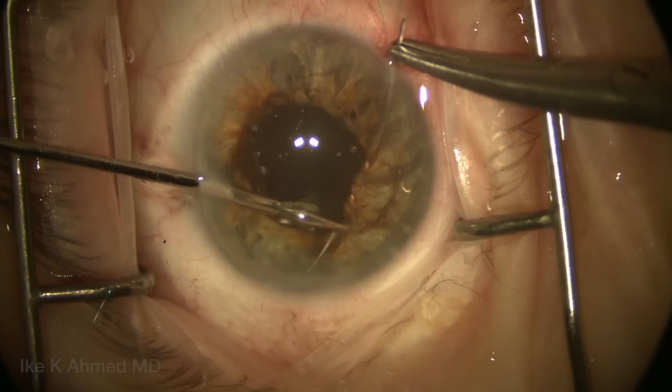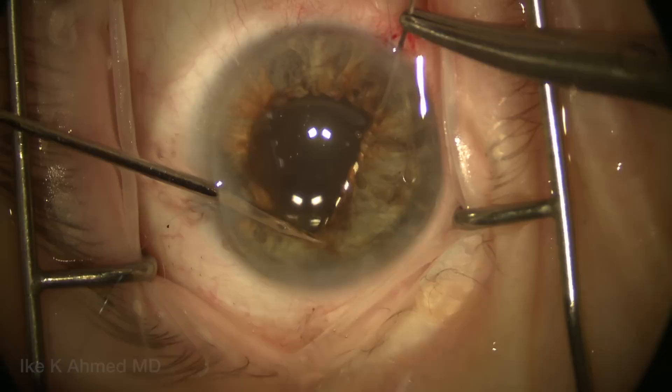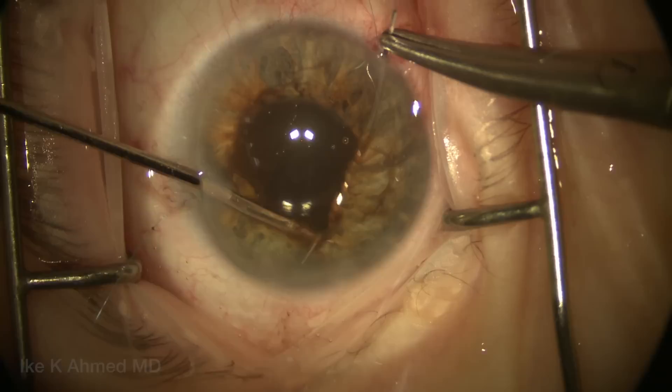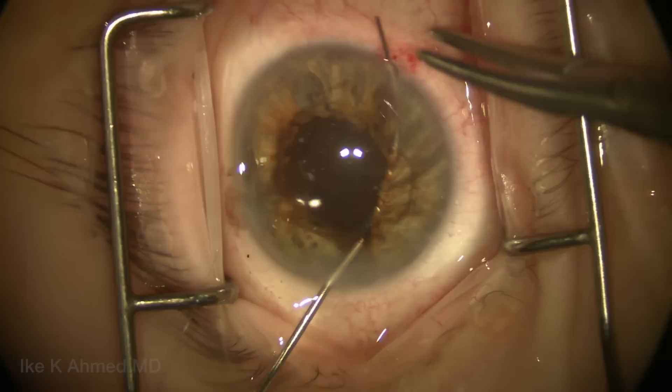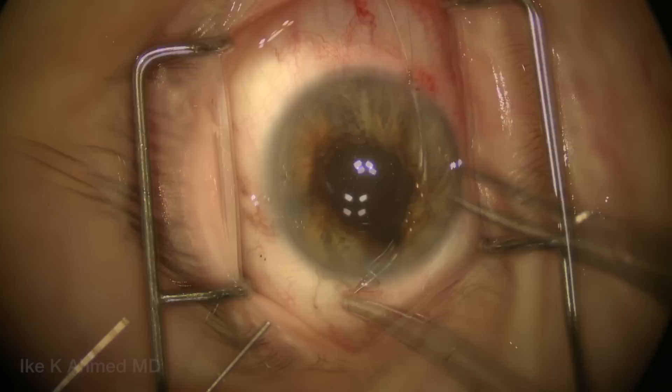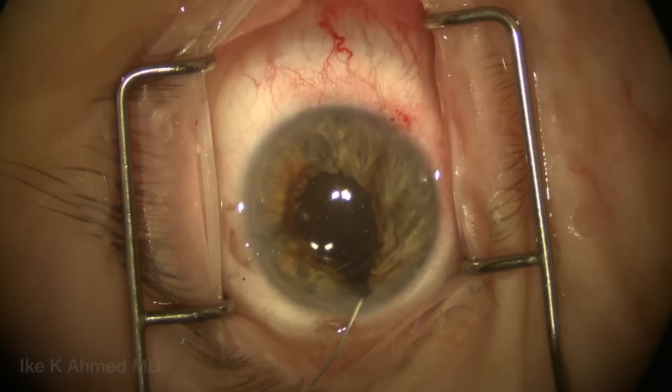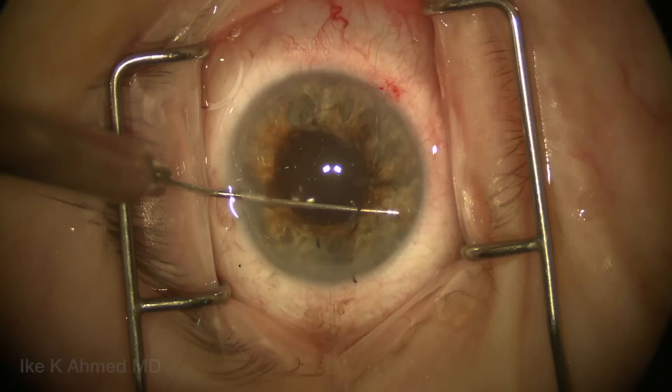Toward the end of this passage — usually the most challenging part — it's important to keep the needle as steady as possible, grabbing as much tissue as we can until we get under the temporal incision. Again using a 27-gauge docking needle to dock the needle and ensure we don't grab any corneal tissue. Once the needle tip is through the incision, it's important to release the docking needle and pull the remaining needle through using the needle driver to allow it to follow the curve of the needle, preventing torquing or tension on the iris tissue. Counter-traction can be used with a Kuglen hook.